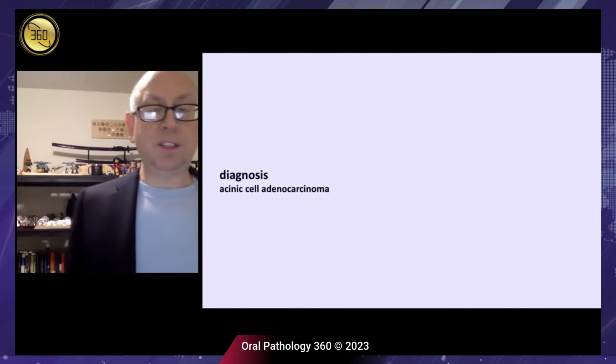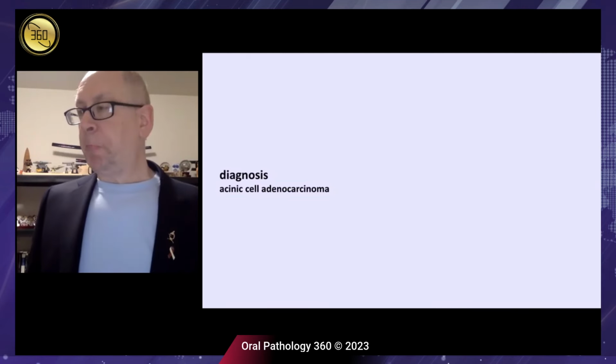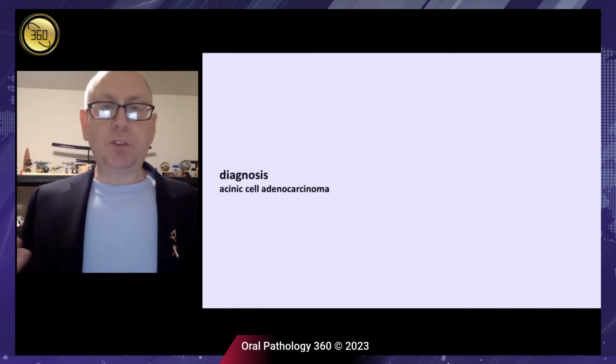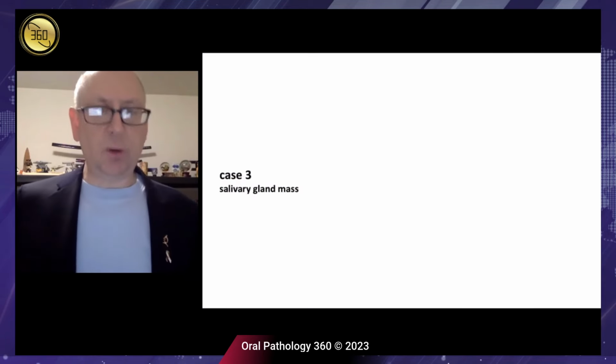And I have an acinic cell. So those are those two tumors that we've learned, when we look at Elena Skálová's work, right, we know that these are tumors that have been teased out as overlapping in their histologic characteristics, but we'll talk about the genetics of those.